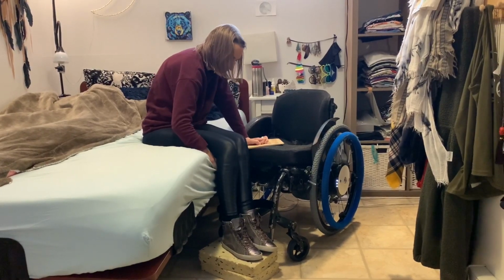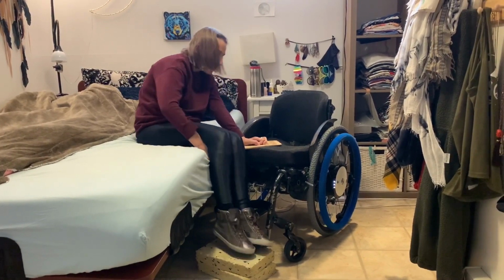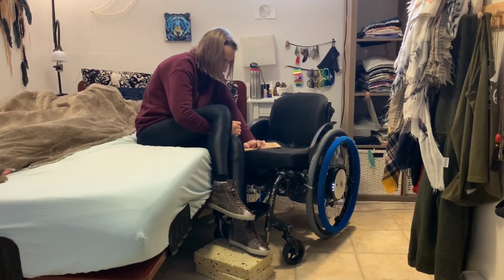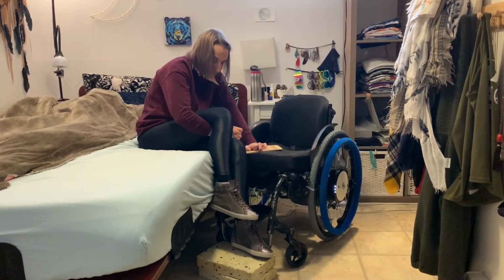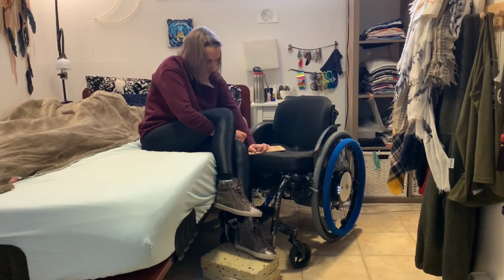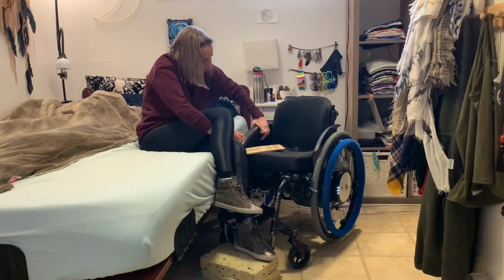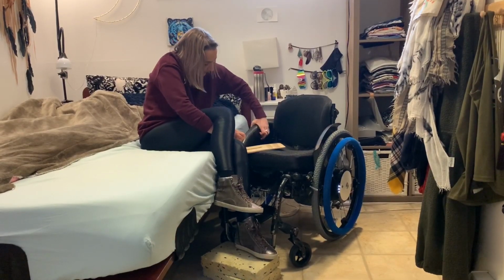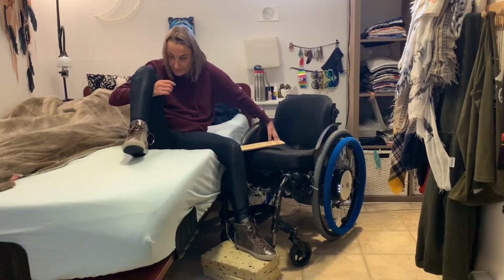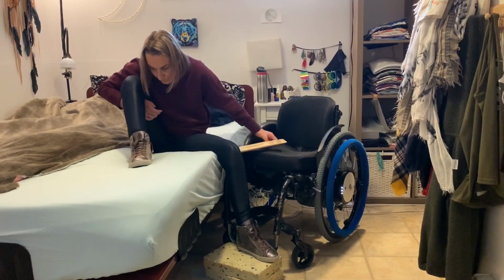Bring my hand underneath. Use my tenodesis to bring my knee up onto the bed. Bring my arm onto the other leg to wedge my weight there, and bring the other hand onto my fender, or the wheel if you don't have a fender, and then the leg out.